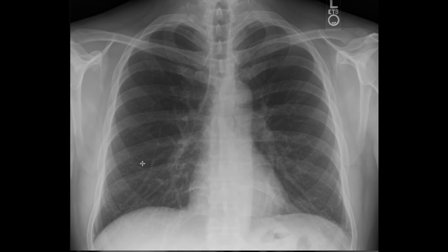This is when the heart is situated in the right thoracic region, and this is when the marking becomes very crucial, because if you have marked the left side when the heart is on the right side, then if the patient is to undergo treatment or a biopsy, the side can be mistaken, and it's a very crucial thing to consider.